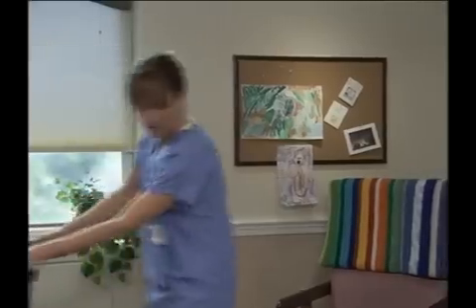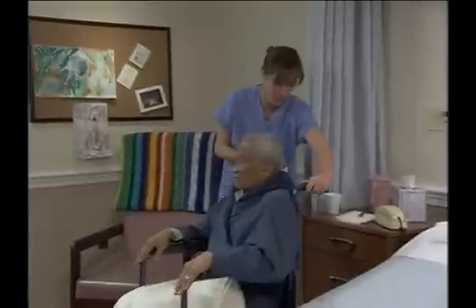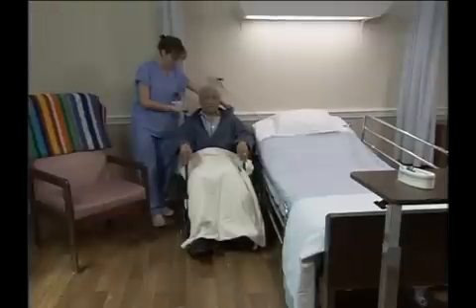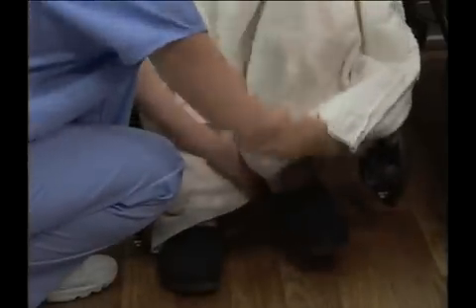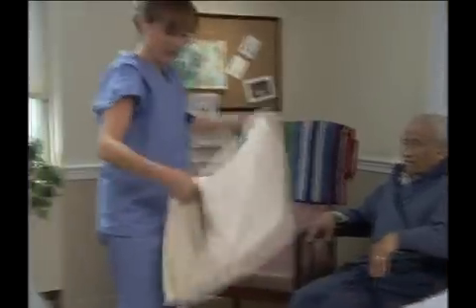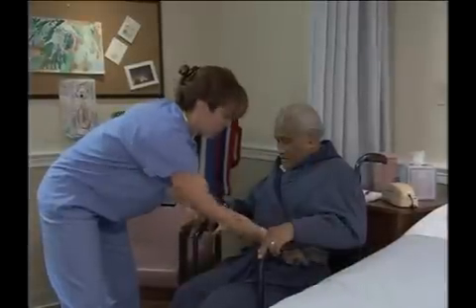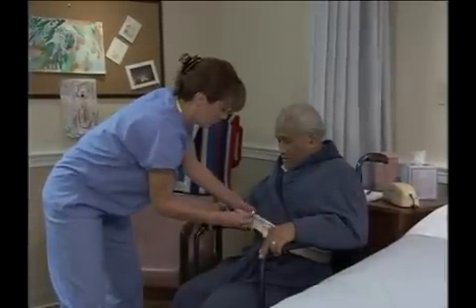If possible, brace the wheelchair against a wall or a solid piece of furniture to keep it in place. The person's strong side should be next to the bed. Lock the wheels of the wheelchair and position the footrests out of the way. Remove the person's lap blanket if one was used and release the wheelchair safety belt if in use. Next, apply a transfer belt as demonstrated earlier in this video.